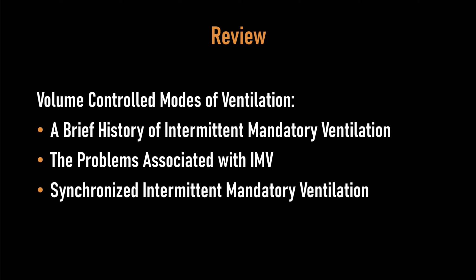Consequently, IMV evolved into a novel mode in the 1980s known as synchronized intermittent mandatory ventilation, where if the patient took a breath within the window of the controlled breath, that was synchronized, that was usually a volume controlled or volume assisted breath, very, very similar to what you see in volume assist control. Outside that window, the breath was spontaneous and was usually supported by a novel mode known as pressure support.